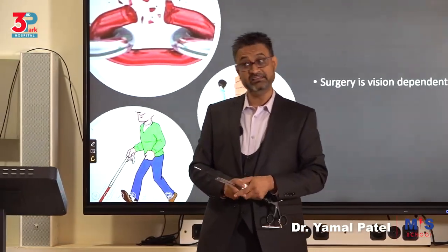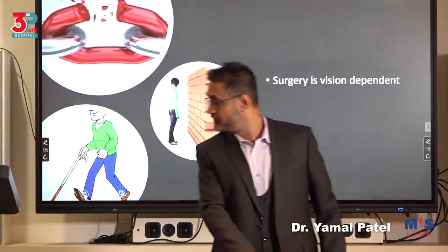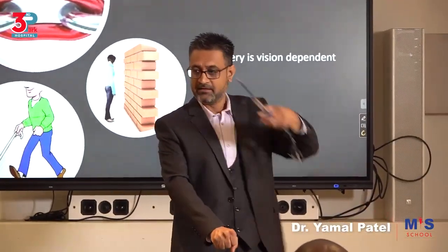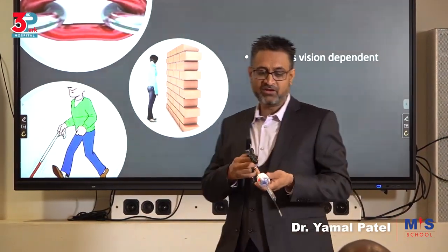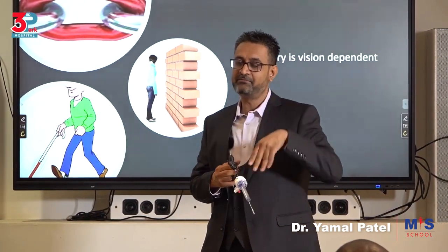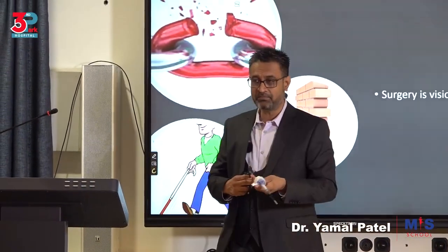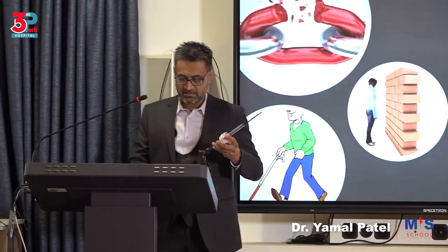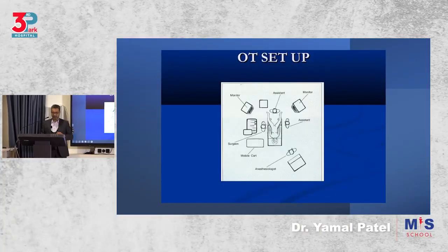In an open surgery, it's different. You have a big vessel there, you just go and put your hand there and then you'll be looking for whatever you want. Okay, get me a mop, you won't have that type of time. If you think you have a bleeder and you're just going to suck out and then think you're going to hold it, my friend, by the time you hold it, that person would have bled half a liter. So you have to be more alert. If you can't see properly, you can't operate. So learn that. Now we move quickly to the OT setup.